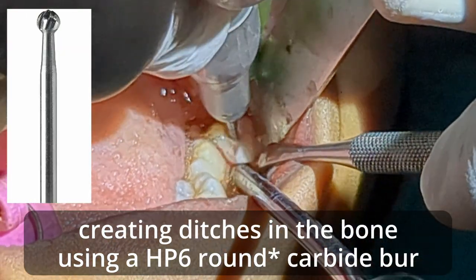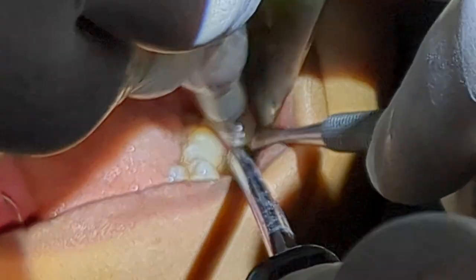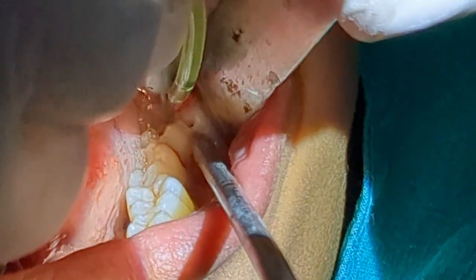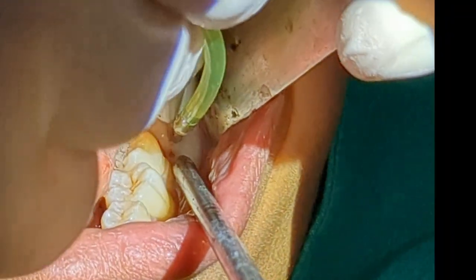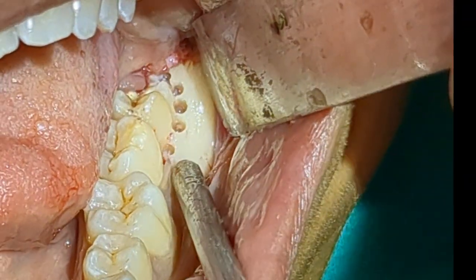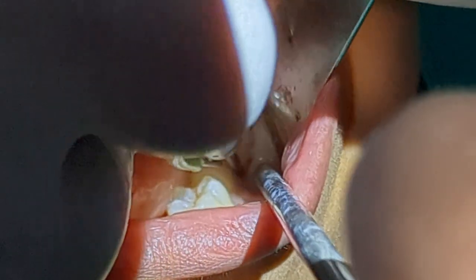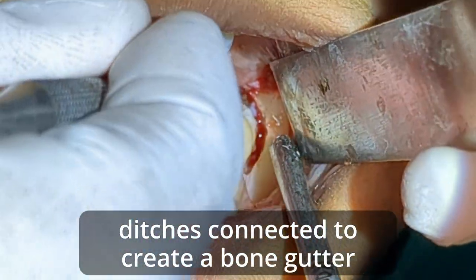What I do is I create ditches in the buccal bone — basically in the bone surrounding the tooth — using the red burr. I'm just creating and making the ditches, and now I have connected all the ditches.